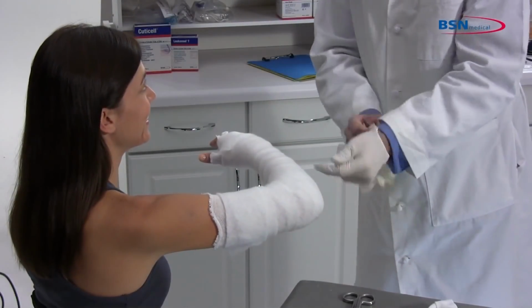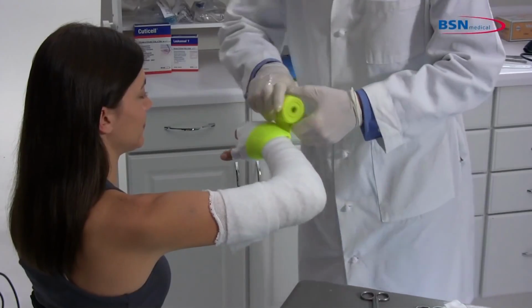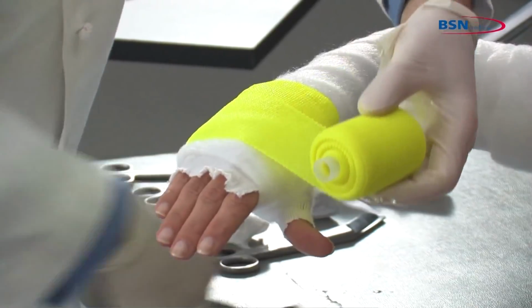Begin by putting on protective gloves before applying the cast tape. Dip 2-inch or 3-inch cast tape in water, squeezing 1 to 3 times. Remove from water and squeeze 1 time to remove excess water.